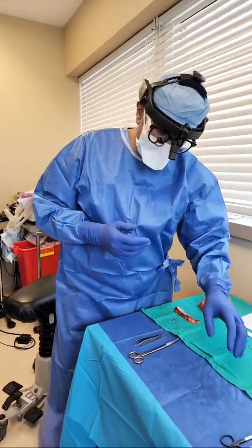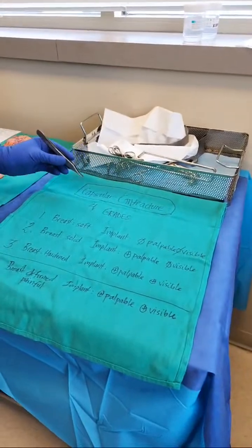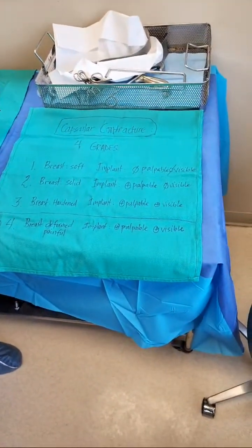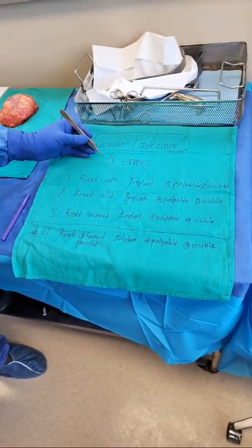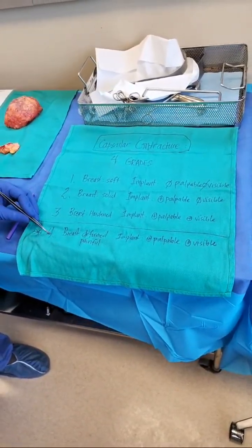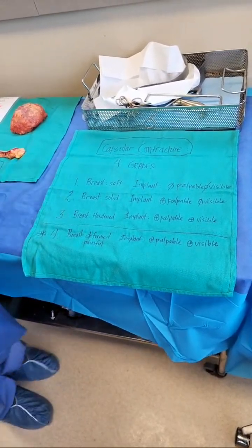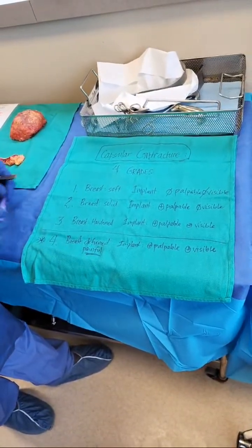And as you will see, people ask me, the patients, what is a capsular contracture? The implants, they all form capsules, just like any foreign body inside the human body. And there's 4 classifications, or what they call the Baker's grade classifications. So our patient has the grade 4. She has a deformed breast that is painful. So this is very important, the painful part.